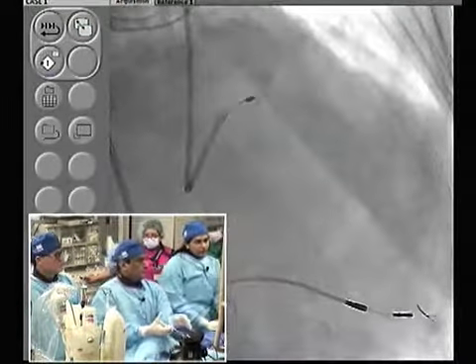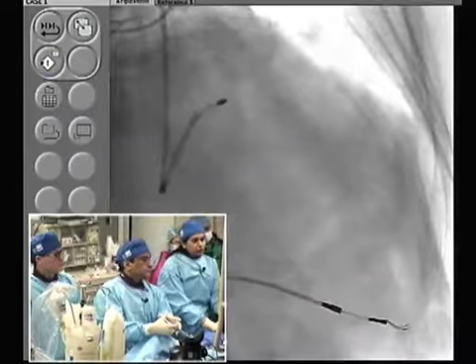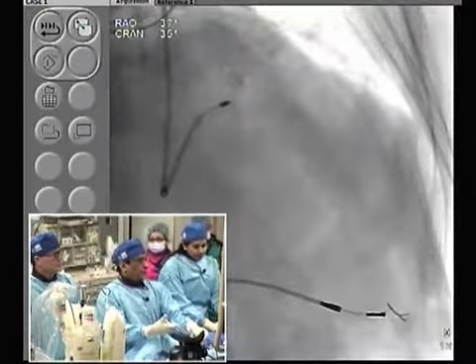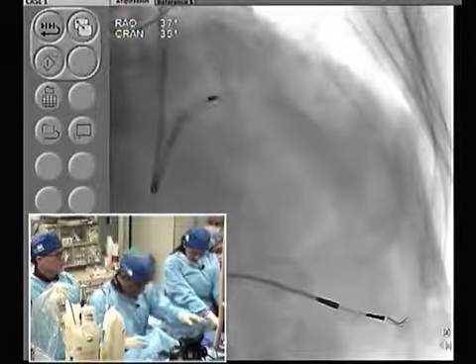Okay, the question would be the same. I know there is a diseased LAD. The plan would be the mid to distal moderate disease, which we want to leave alone. So we did not do the rotablator in that area. Excellent, valuable teaching points. We are done up to the early mid, not the later distal part of the mid. Yeah, mid, truly mid and distal.